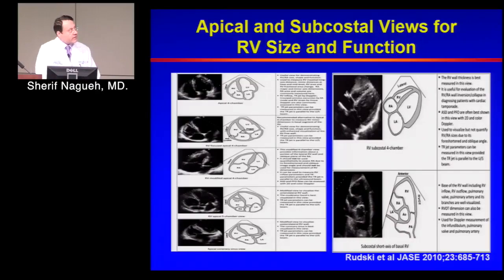Where do you measure it in the thickness? Again, end diastole. You want to exclude the pericardium. You would include the epicardium. You go all the way mid-wall and to the endocardium, and that's the thickness that you end up measuring. This view also gets you a look at the interatrial septum, interatrial shunts, tricuspid valve, tricuspid regurgitation. You can try and align with them.